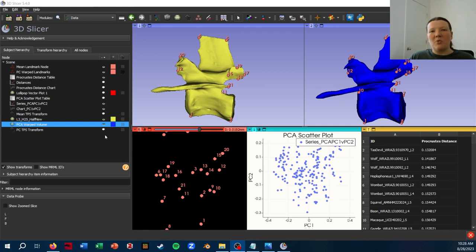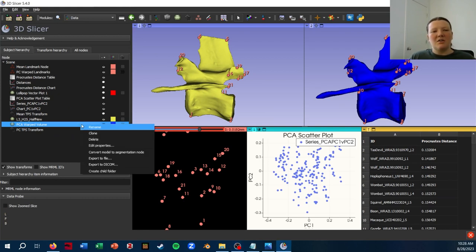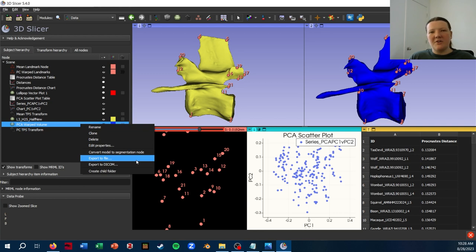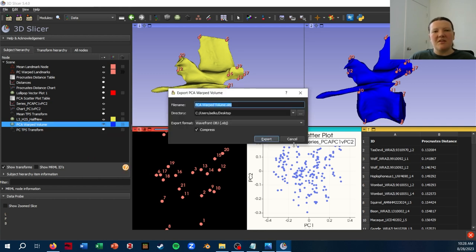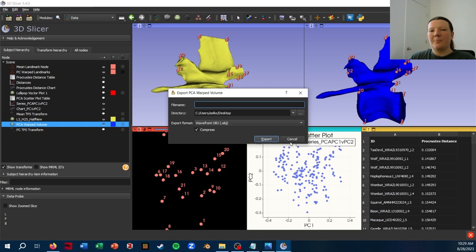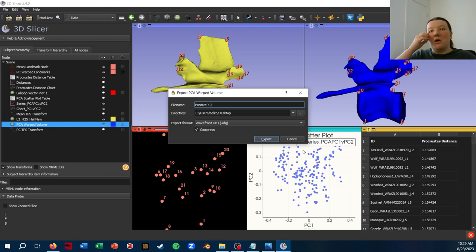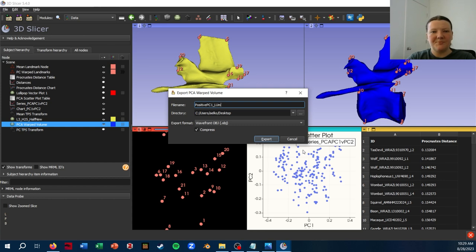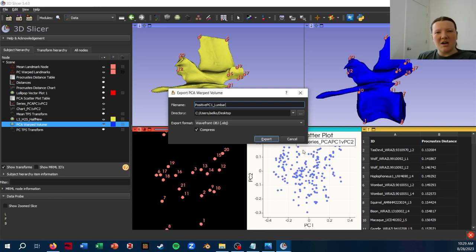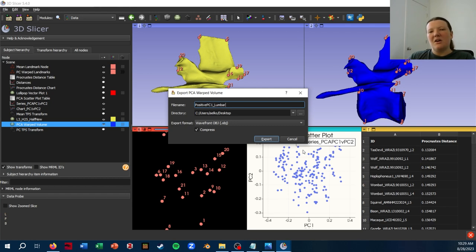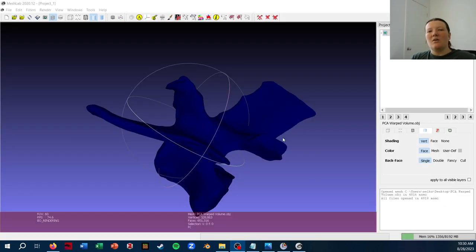So now that's been applied and the mesh is going to stay this shape. Okay. Once I've hardened the transform, I can either right click and export to file or use the Save button and then save it probably as an OBJ. I would also want to name it something like positive PC1 lumbar just so that I know that it is specifically representing the positive end of PC1. In this case, alright.